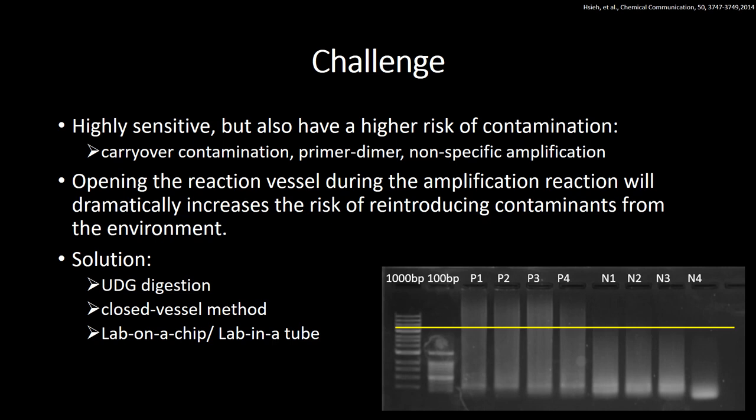Heaps of research shows that opening the reaction vessel during the amplification reaction will increase the risk of reintroducing contaminants from the environment. Now that I dedicate to solving the problem of contamination and non-specific results, we are seeking a closed vessel method that can lower the risk of carryover contamination. Using microfluidic system to perform lab on a chip is a good choice.